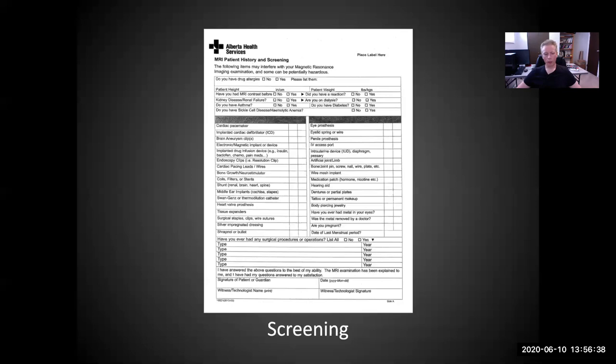So you get a lot of common things like they've had a broken bone and it's been set, etc. And generally speaking, if you're knowledgeable, then you already know which ones might be relevant. But if you're not, this is a good time to catch anything that you may not know the answer to and bring it up with a qualified technologist or operator.